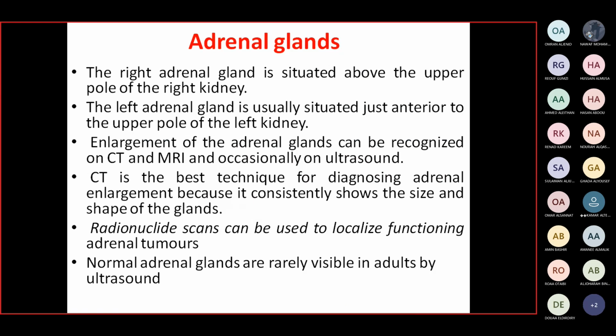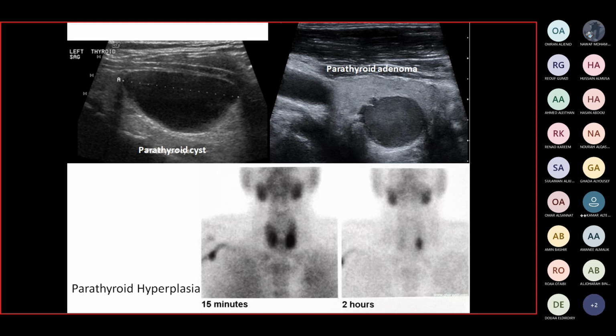Doctor, what do you mean by 15 minutes or 2 hours? What's the difference between 15 minutes and 2 hours? Yes, this is 15 minutes, the time of the scan. It is 15 minutes after the injection of the radioisotope. And is this normal at 15 minutes?